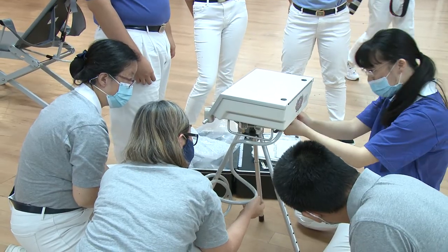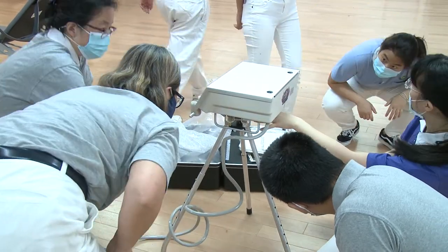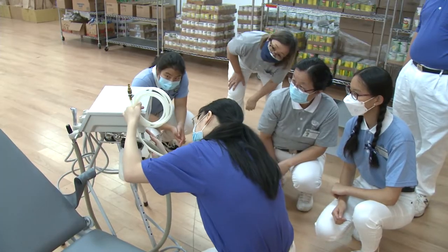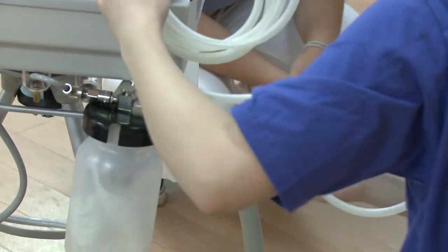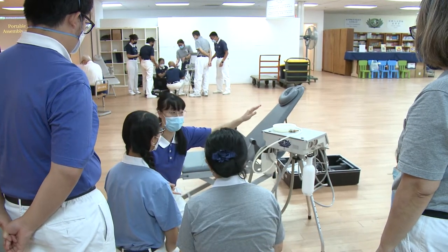And then there's also one more knob up here. My hand is right here. This is also the stop-the-boost button. This one stops it. This end goes into the machine. We have two holes here, okay? One is all silver, and the other one, if you look real close, if you want to take a peek down here, there's a blue plastic ring around it. Blue is for water.